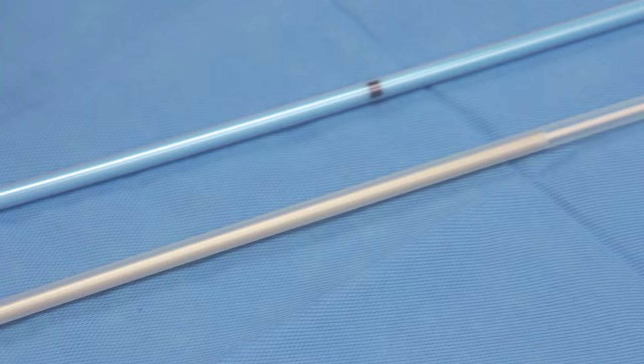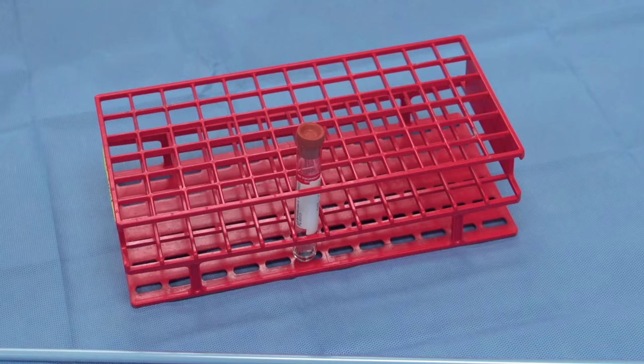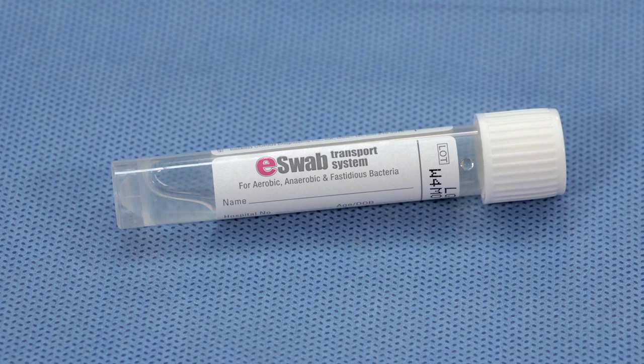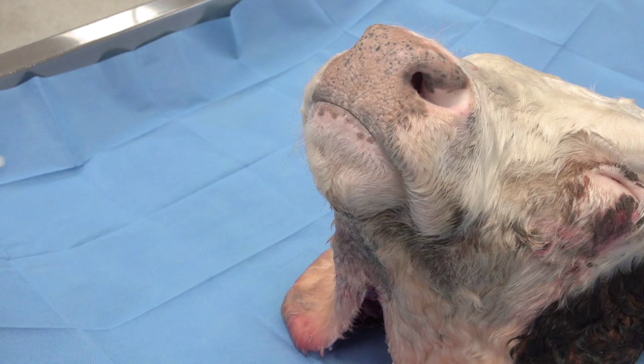For this procedure, a guarded equine culture swab of appropriate length is required. Only one sample is required for each animal. Additionally, a sterile container which contains either Amy's transport media or 0.25 cc's of sterile saline is needed. Amy's is the preferred media, although both mediums are appropriate for viral and bacterial PCR assays and bacterial culture. A pair of scissors and permanent marker is also required.